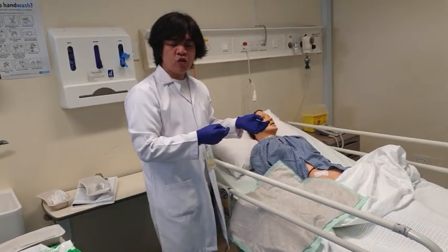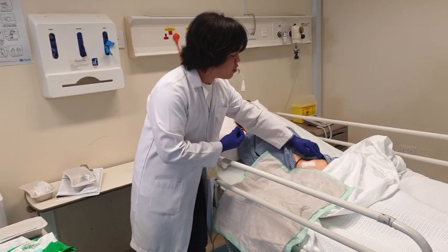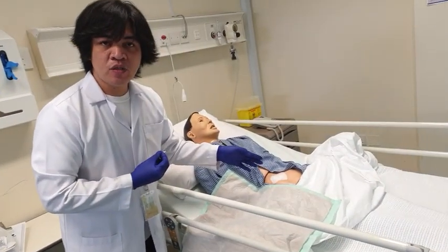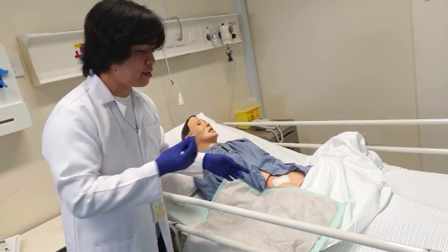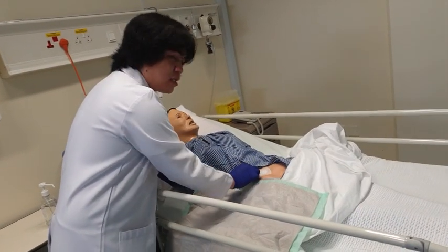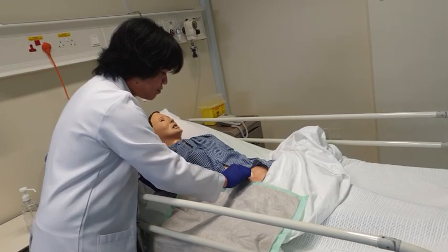I want you to observe the proper way of removing the dressing. This old dressing sticks well into the skin, and you cannot remove it without using adhesive remover because it's very, very painful to your patient. With the use of your adhesive remover, apply it onto the sides of the dressing.